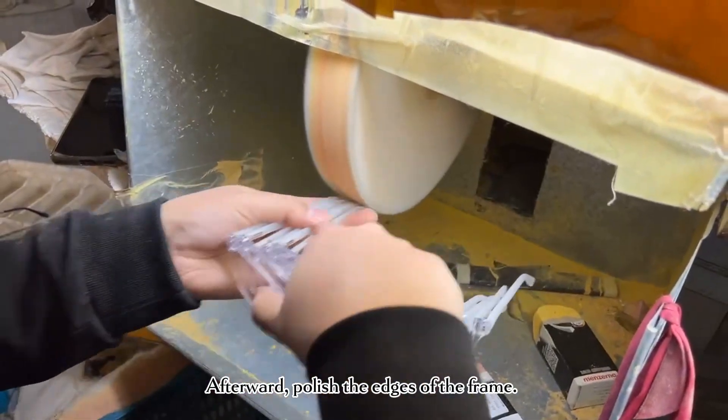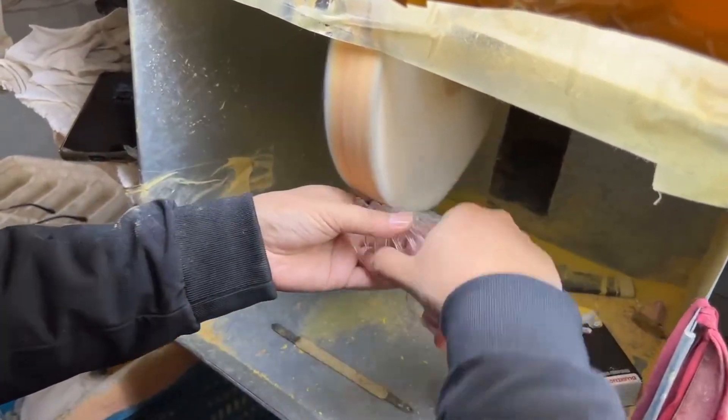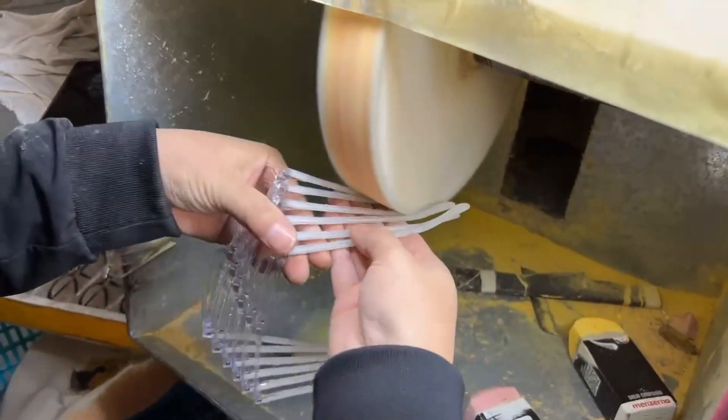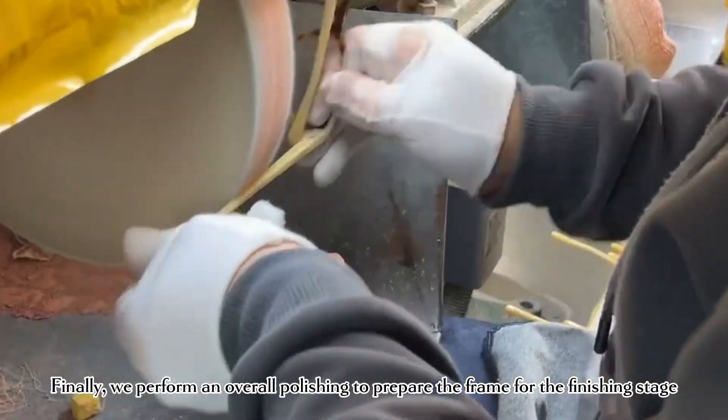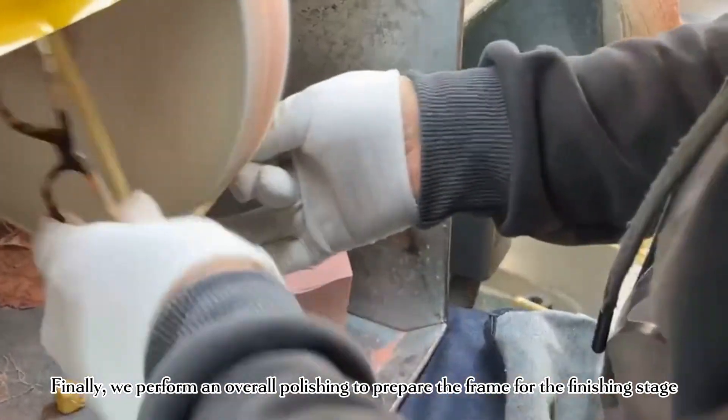Afterward, we polish the edges of the frame. Finally, we perform an overall polishing to prepare the frame for the finishing stage.